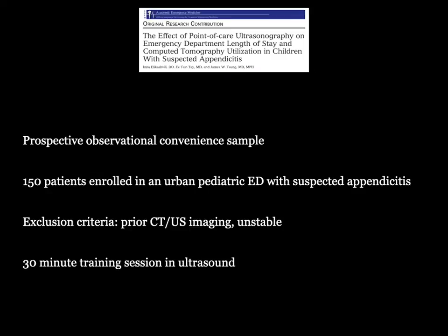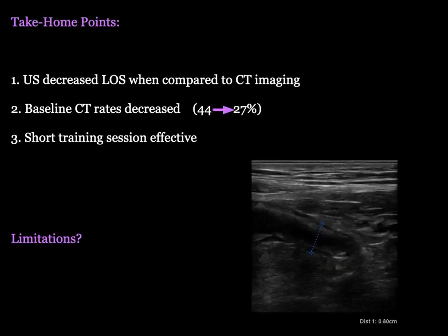And they were really looking at whether the use of point-of-care ultrasound could not only diagnose appendicitis, but whether this could reduce length of stay in the emergency department and reduce the number of CT scans performed in the emergency department to look for appendicitis.